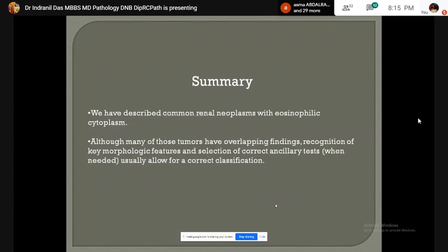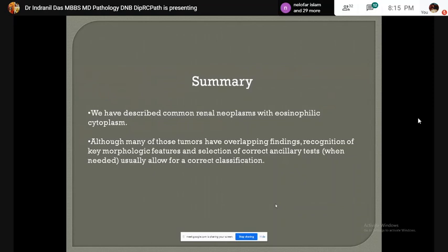In summary, we have described common renal neoplasms with eosinophilic cytoplasm. Although many of these tumors have overlapping findings, recognition of key morphological features and selection of correct ancillary tests usually allow for correct classification. Thank you.